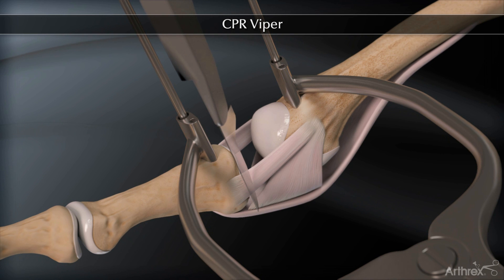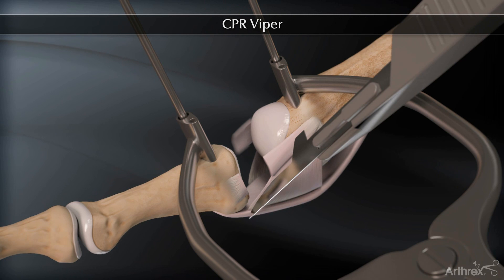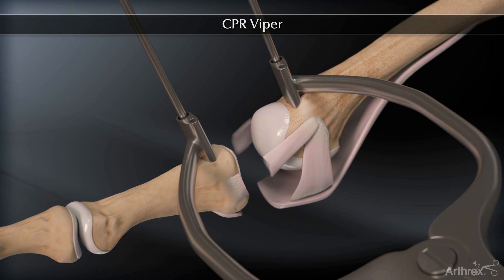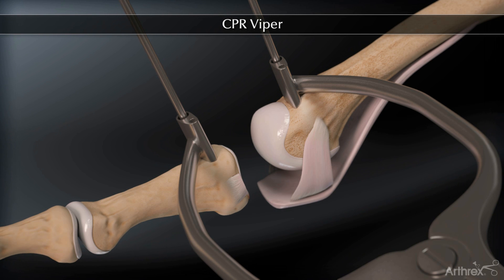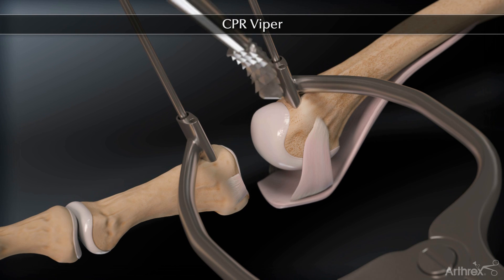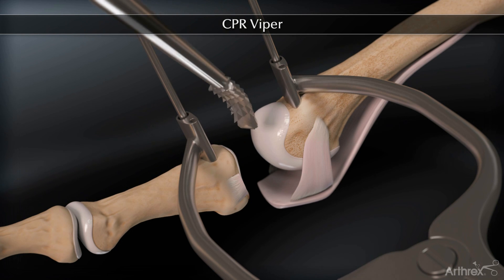We release the medial and lateral collateral ligaments off of the base of the proximal phalanx. We recommend that you release the plantar plate from the base of the proximal phalanx with sharp dissection, with care taken to protect the flexor tendons. It's important to release the plantar plate as close as possible to its insertion into the proximal phalanx. A rasp or rongeur may be used to roughen the surface where the plantar plate has been released.